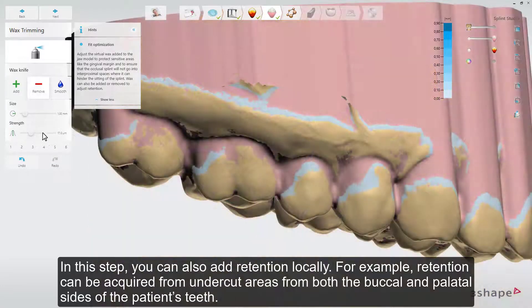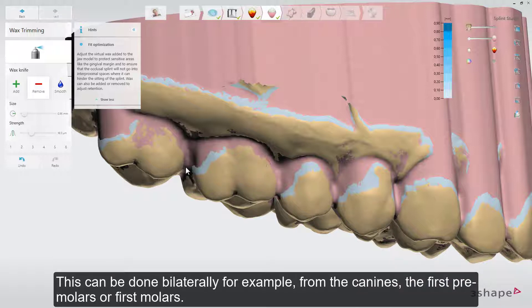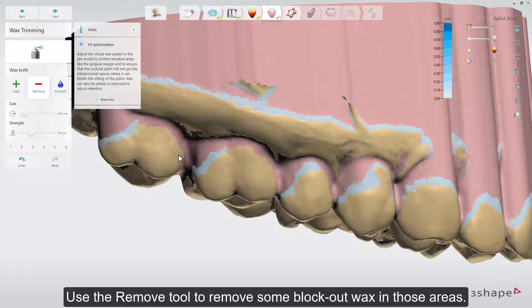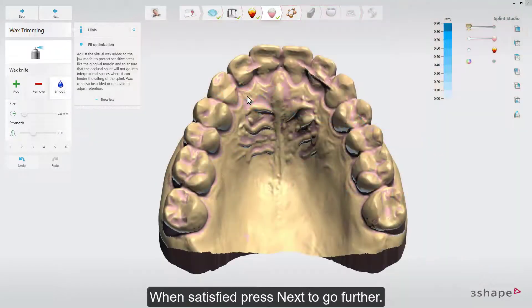In this step, you can also add retention locally. For example, retention can be acquired from undercut areas from both the buccal and palatal sides of the patient's teeth. This can be done bilaterally, for example from the canines, the first premolars, or first molars. Use the Remove tool to remove some block out wax in those areas. The color scale informs you how much depth the local retention area has. When satisfied, press Next to go further.